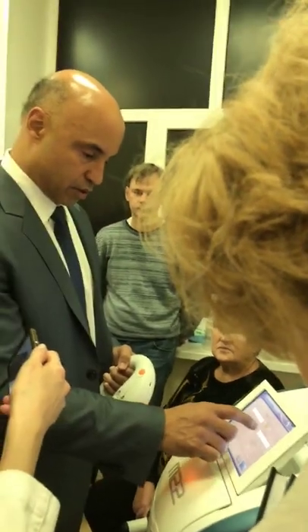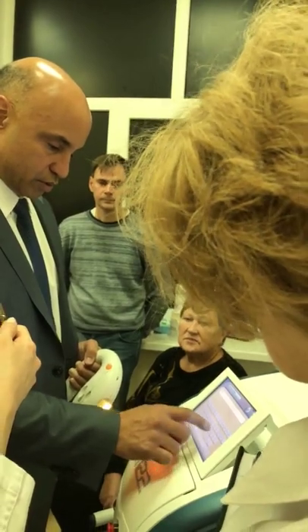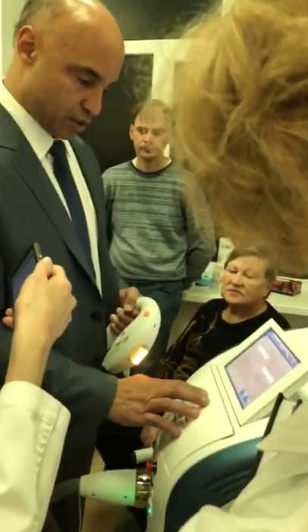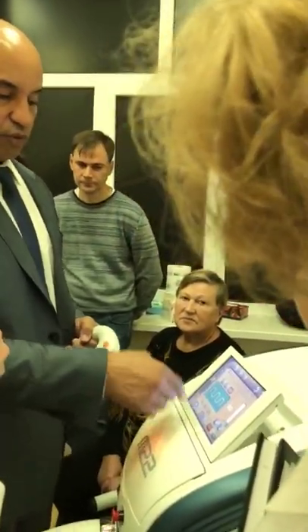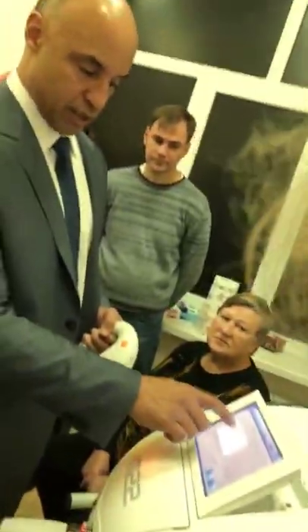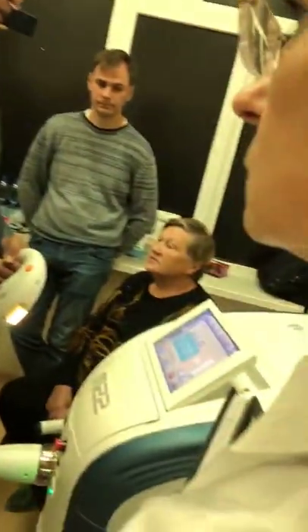Set to Toyos IPL. Check. Okay. So whenever you want to start the machine, get it on IPL and then just go here. It'll be Toyos IPL. You just click there and then you're all set. Если вы когда захотите, ну, как пользоваться ходом машины, то вот здесь вот параметры, ну, как вот Toyos IPL, и, соответственно, идем в базу данных, нажимаем на эту строку, и вот эти данные, они нам автоматически уже появятся. Все данные мы можем сохранить.